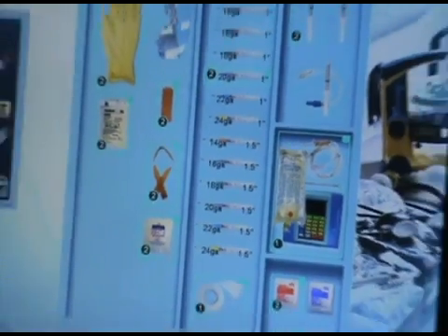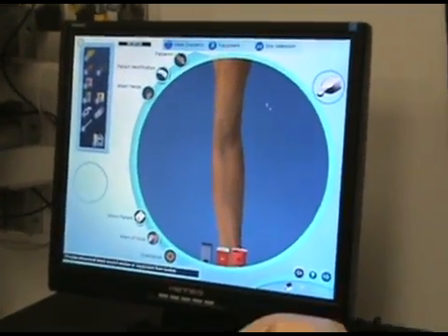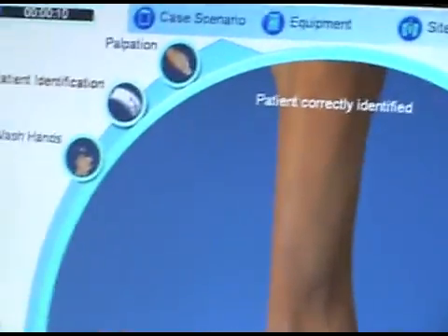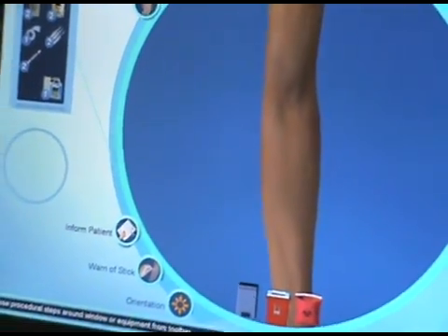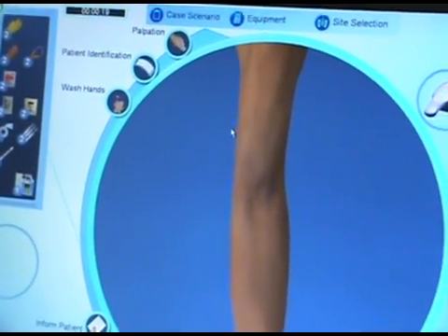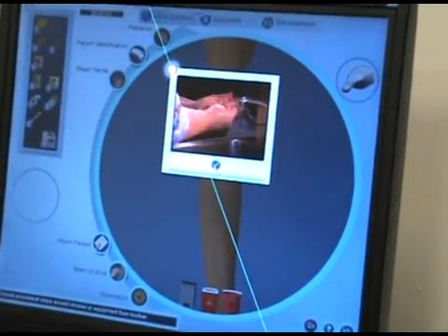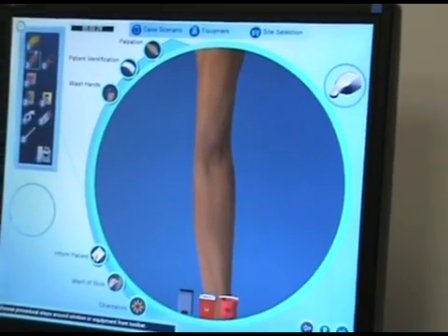Now we're going to go and do our IV. First, we have to identify the patient — verify that the patient is correct. The patient is correctly identified. Then you have to inform the patient that you're going to do the IV. Afterwards — the first thing a lot of people forget — you have to wash your hands to make sure you're doing it clean. Then you don your gloves.